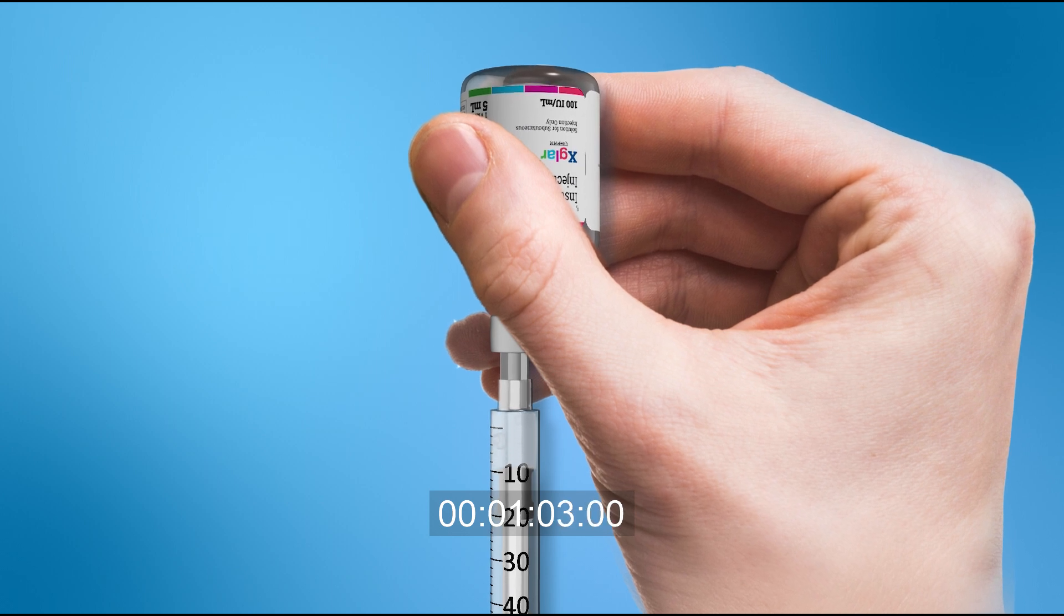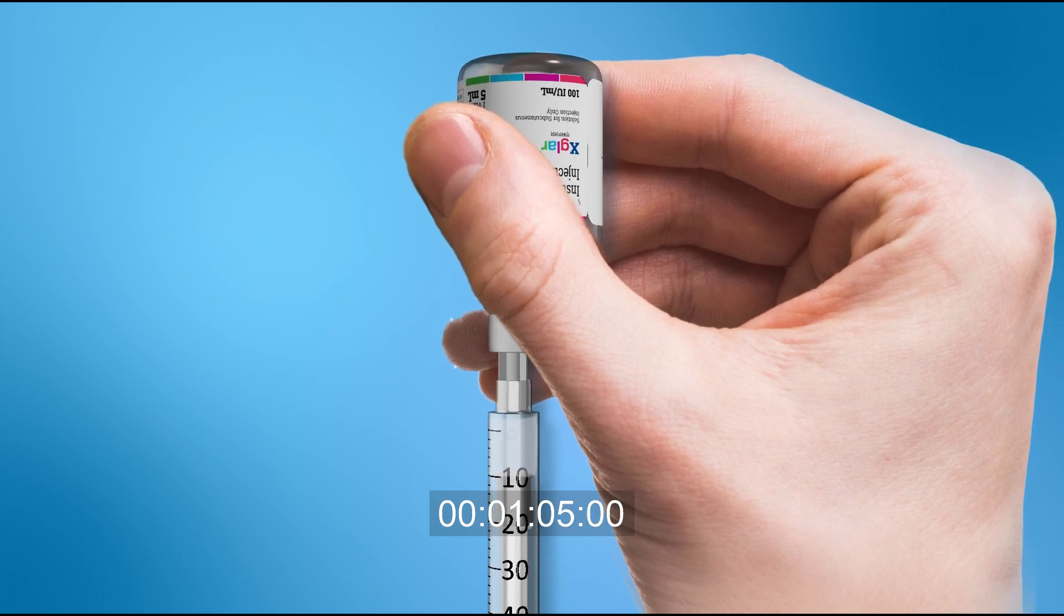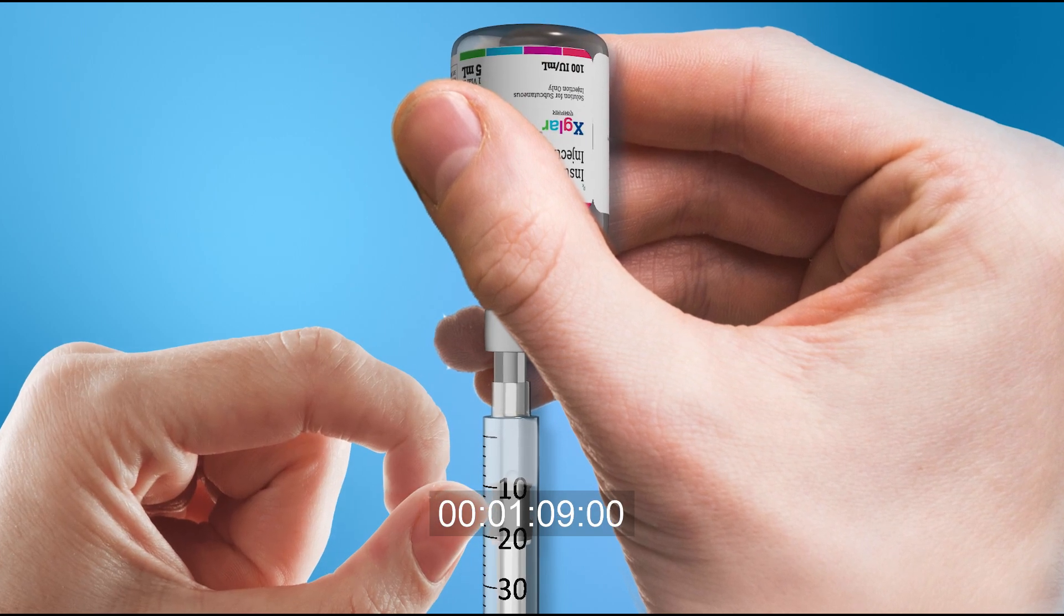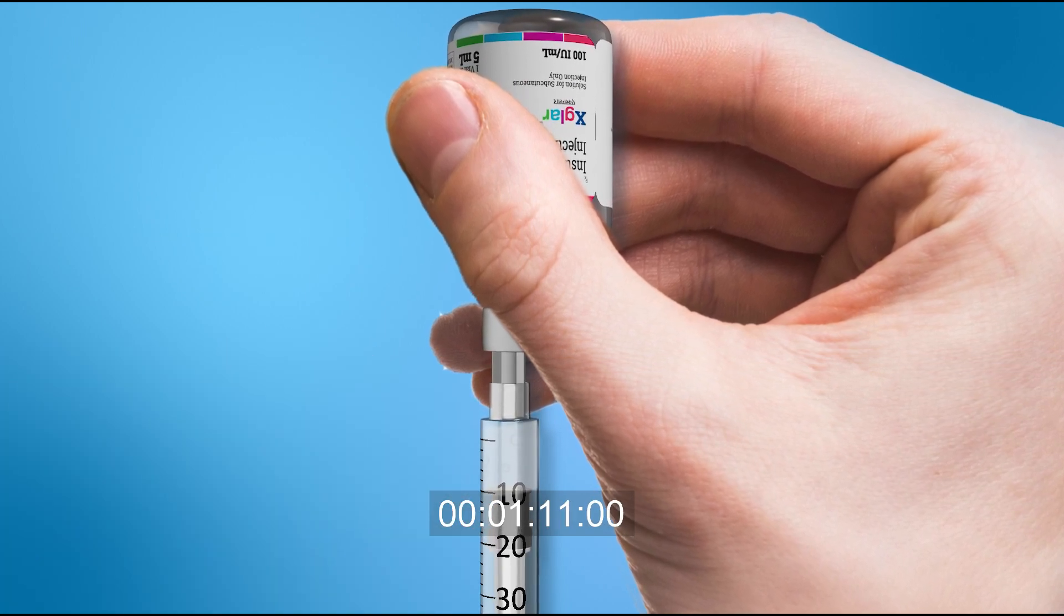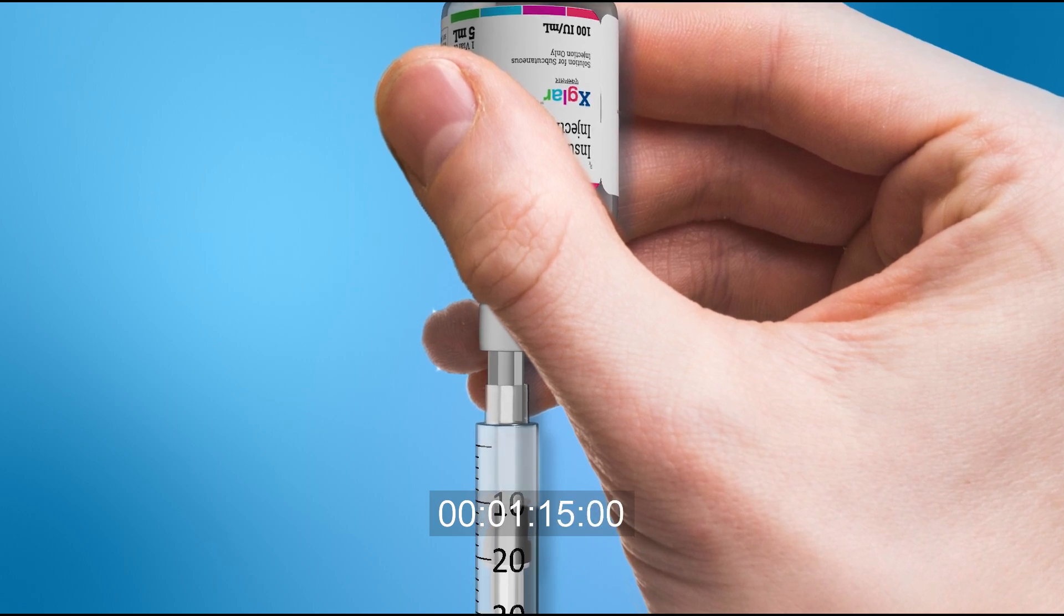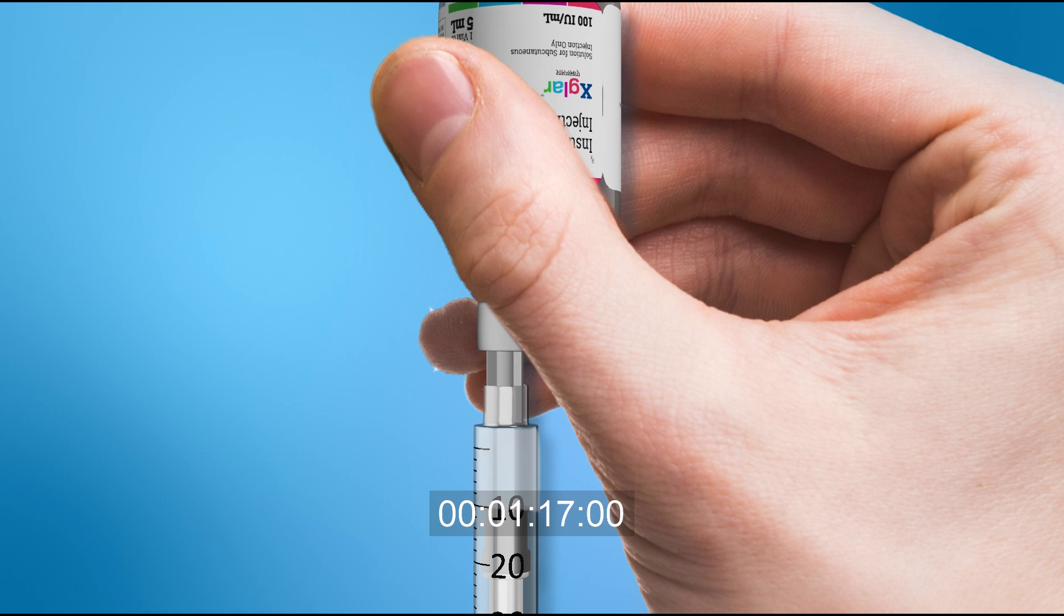Check the syringe for air bubbles. If bubbles are present, hold the syringe straight up and tap the side until the bubbles float to the top. Push any bubbles out and be sure to correct the number of units in your syringe.